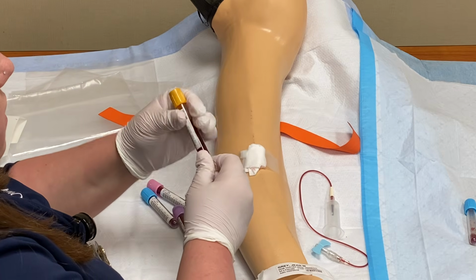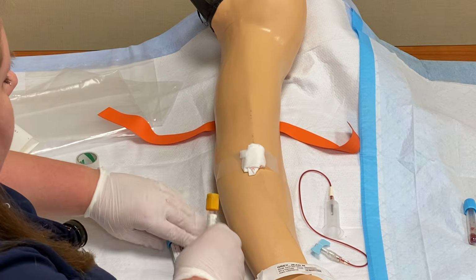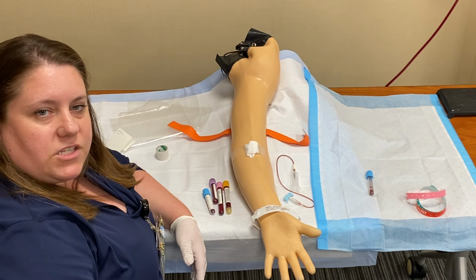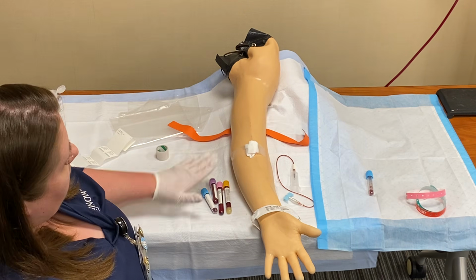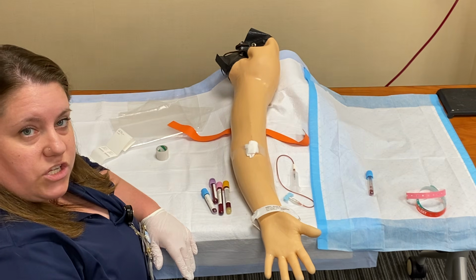Now, different units have different practices regarding blood specimens. So if your unit wants a nurse to check off your specimens before you send them, that's fine. Like I said, different units do different things, so you might see something on your unit. At this point, I have collected my sample, and now I need to clean up my patient's room.